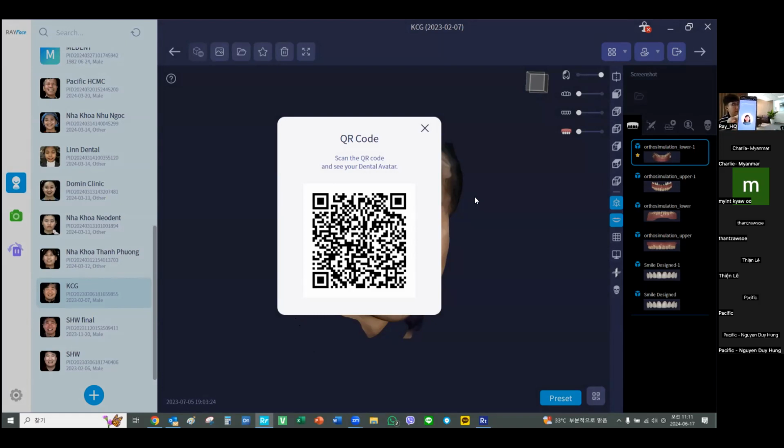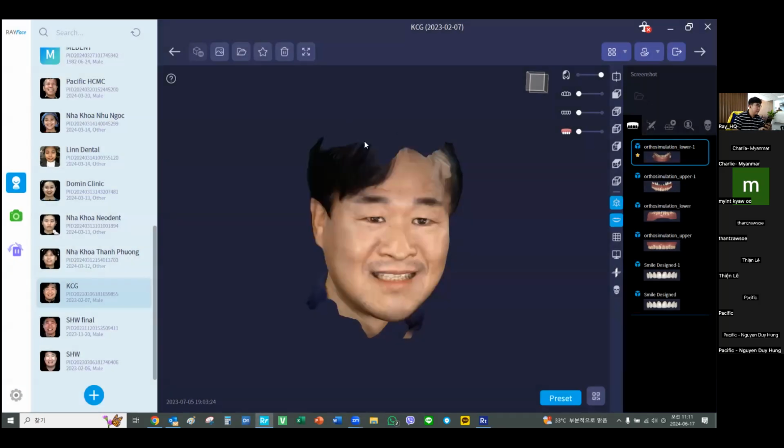My cell phone is downloading the data. It's taking quite long because of the network, but I will show you after the download.